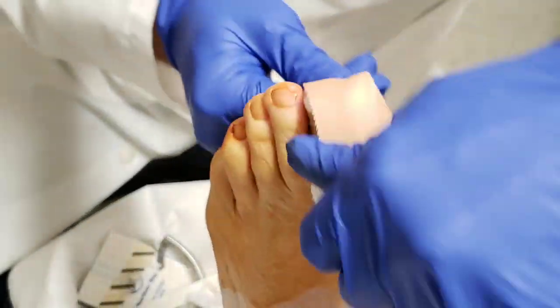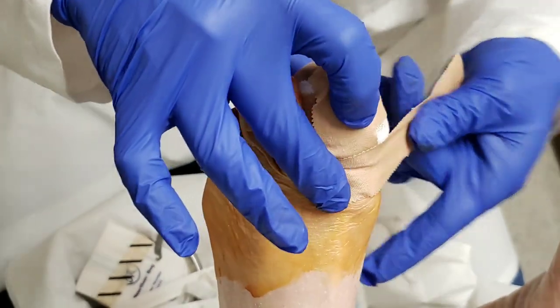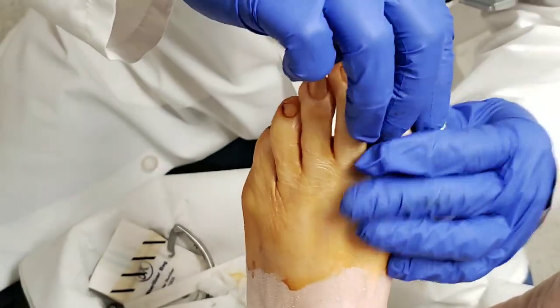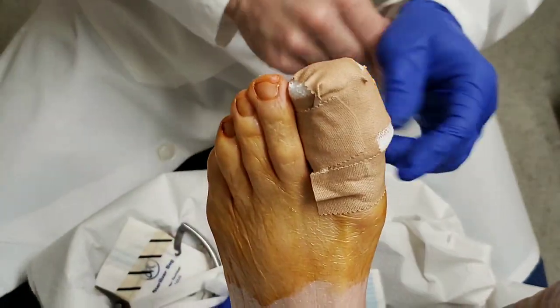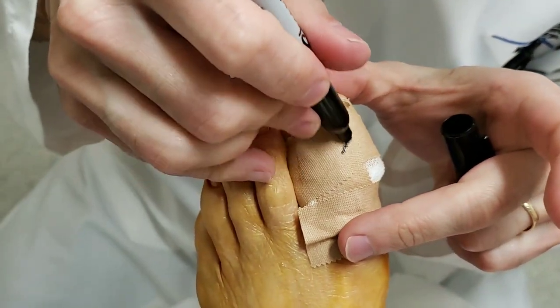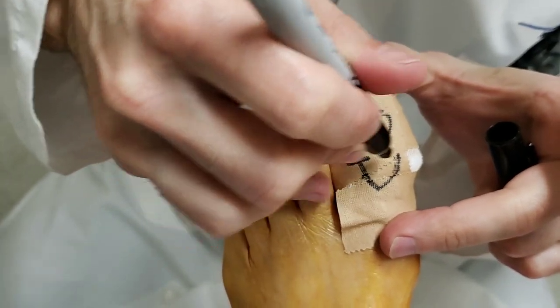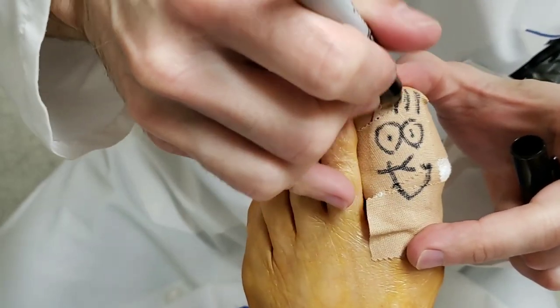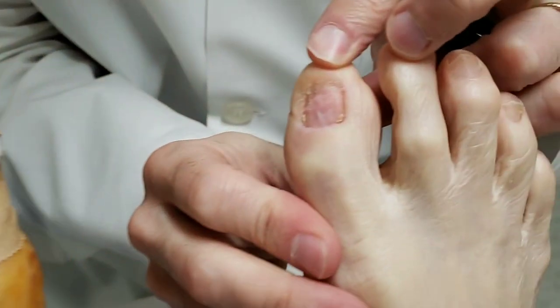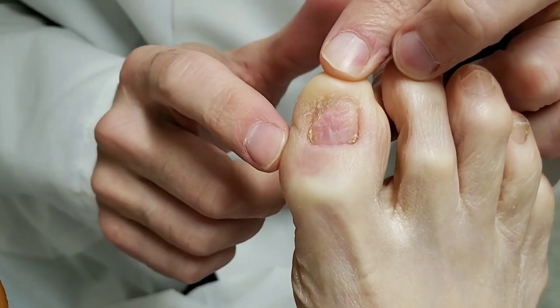This is the part my kids like the best. My kids are three and four right now, and they like to watch my videos. The reason they like it is because of my favorite part right here, where I do a little smiley face — this kind of keeps my patients entertained. So this is what it's going to look like afterwards, but hopefully without these little spicules inside and the nail edge. They just trim them if they're there.